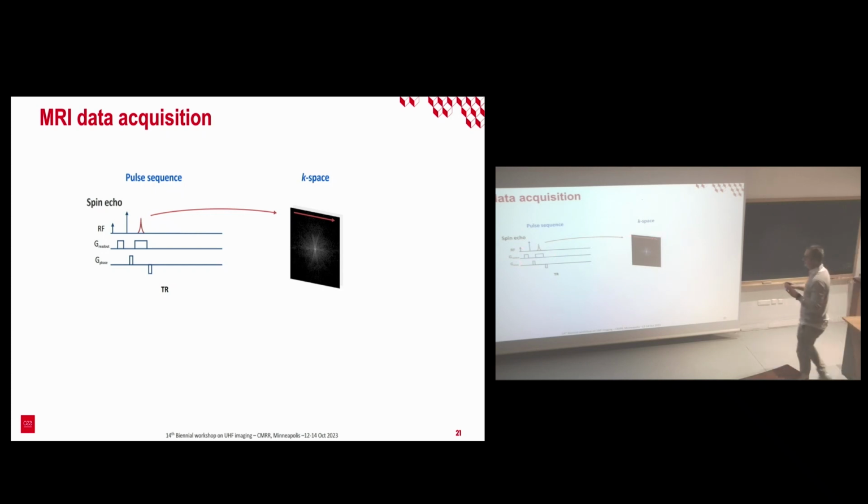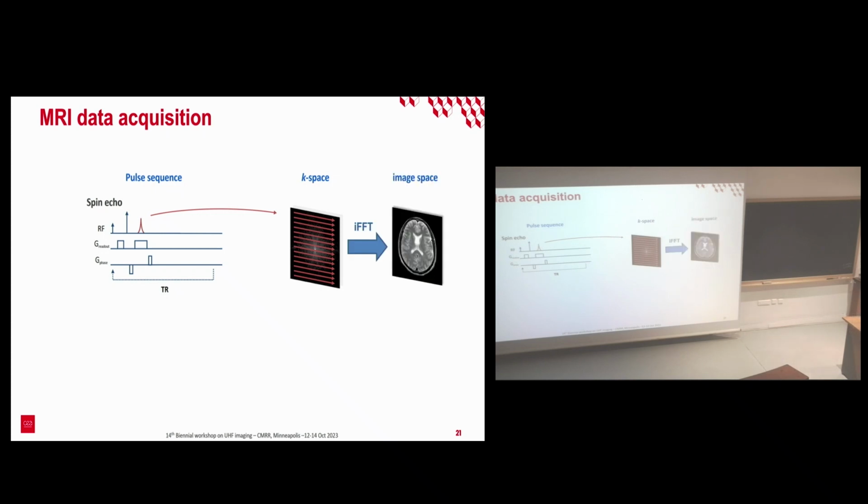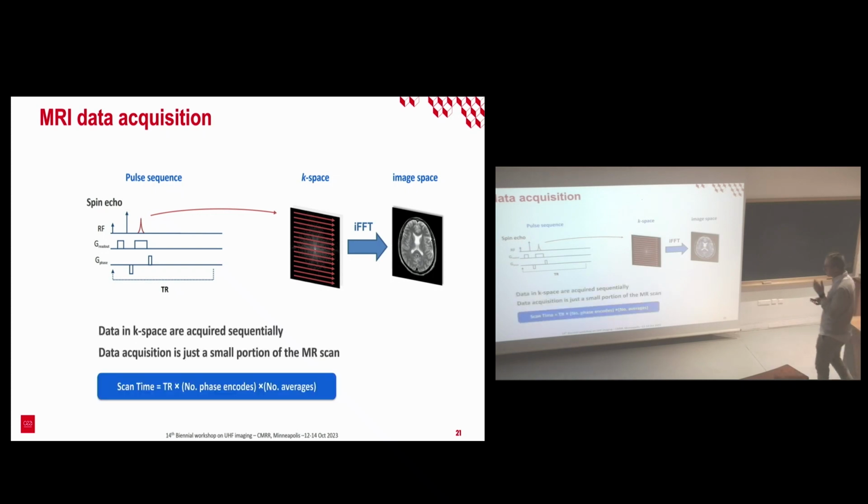And here it's a very simple example. We're going to do exactly what Matthias talked about yesterday morning, the spin warp approach. Cartesian acquisitions, line by line, so very lengthy, very long in time. And so we do that, we repeat the process, and so on and so forth, and we basically fill up the Cartesian grid. And then, because we have a full k-space, we can apply an inverse Fourier transform to get an image. Okay, so it works. But it's pretty long.